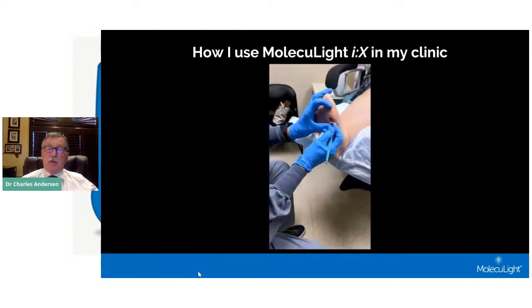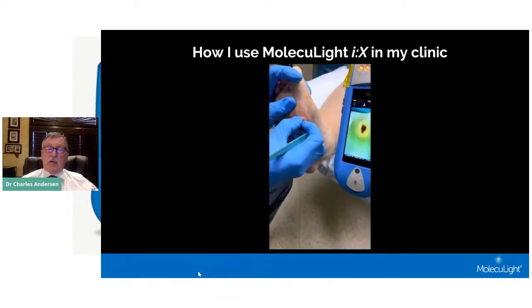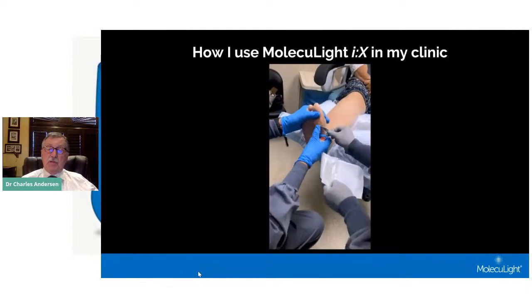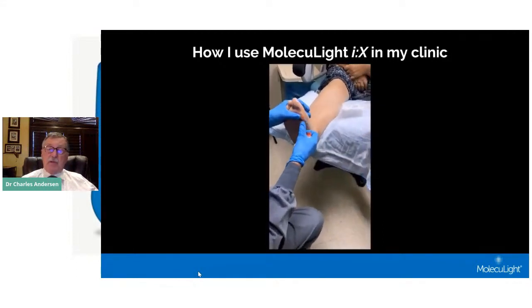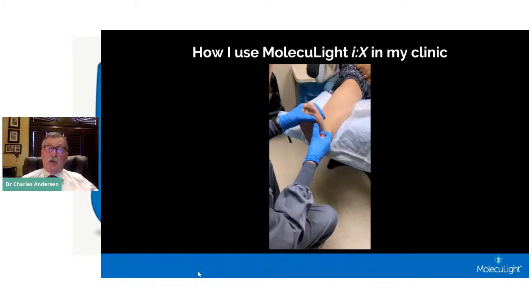What we can do then, once we have finished that debridement, is rescan the wound to see if we've removed the fluorescence or the bacteria around the wound. Now, this is a patient with a diabetic foot ulcer that we're also using biologic tissue on. We feel very strongly that if you put biologic tissue on a colonized wound, you're just wasting a lot of money. And as all of you know, some of these products cost as much as $2,500. So prior to the placement of any expensive biologic tissue, we make sure that there's been adequate debridement, that we've removed any bacteria as judged by the fluorescence, and then we proceed with the application of the biologic, appropriately offload that patient and apply a total contact cast.